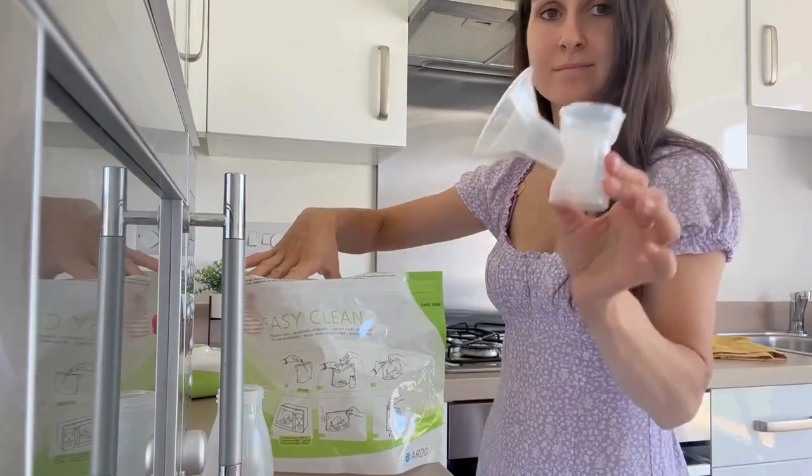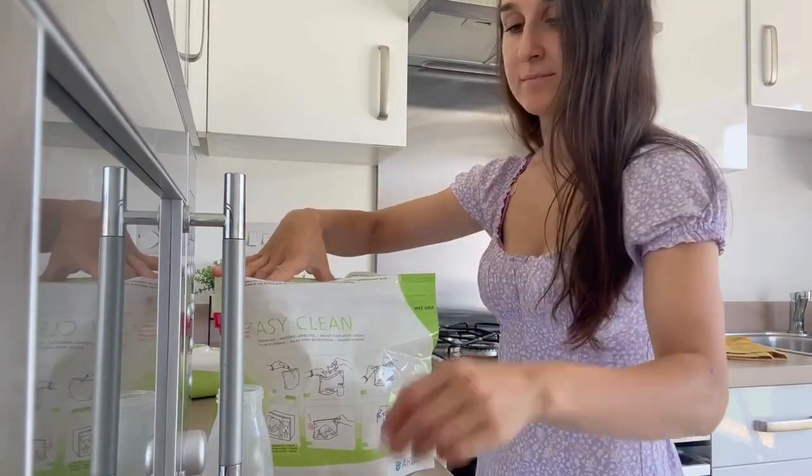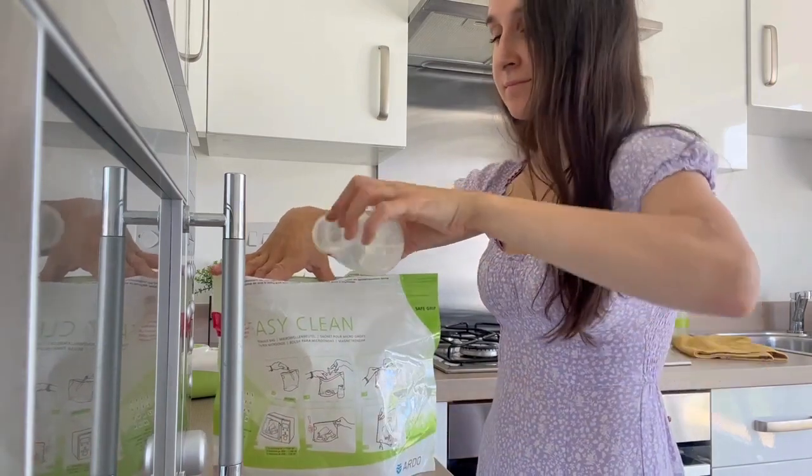Before using the pump we want to sterilise the brass shell, the membrane pot, the lip valve and bottle. However it is really important to make sure they are completely dry before using the pump. Don't immerse the green lid or the silicone tubes in water — if they are dirty give them a wipe with an antibacterial wipe. They need to remain totally dry; if they get wet, water can get inside the pump causing damage which will then affect your warranty.